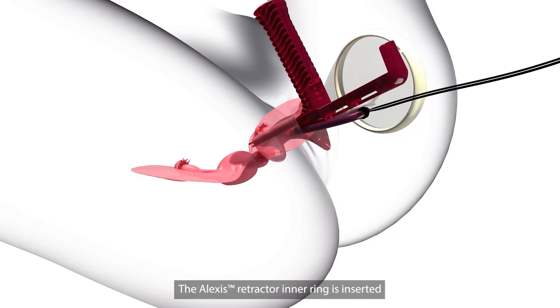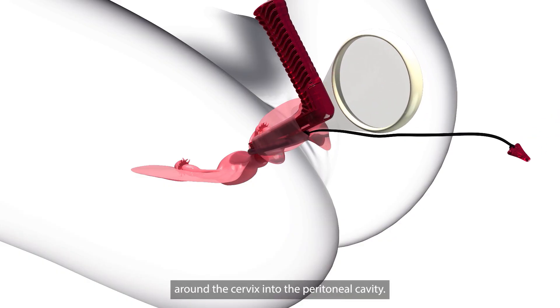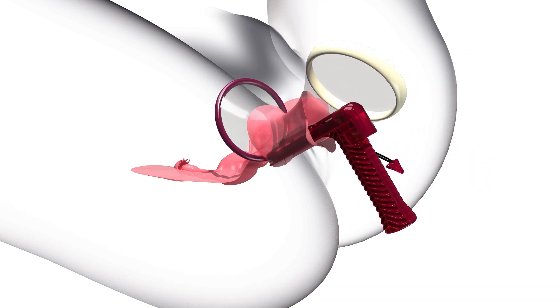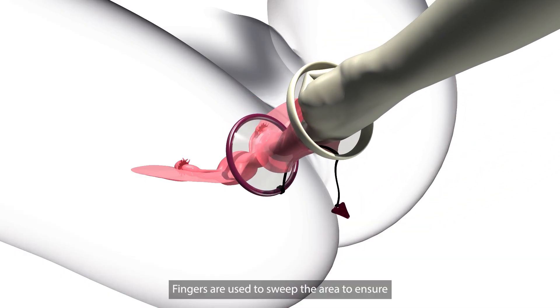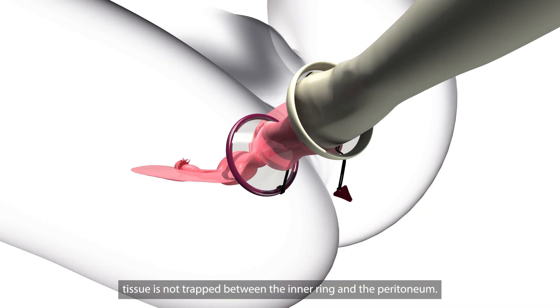The Alexis retractor inner ring is inserted around the cervix into the peritoneal cavity. Fingers are used to sweep the area to ensure tissue is not trapped between the inner ring and the peritoneum.